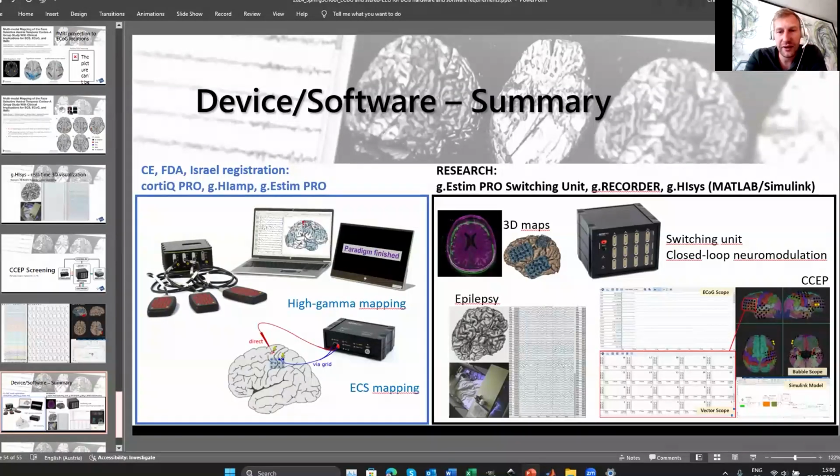Well, I think there is actually a big debate about whether the penetration of the stereo-EEG is influencing the brain or not. So in terms of symptoms, it's not known yet that the sEEG shafts are causing obvious brain damage.